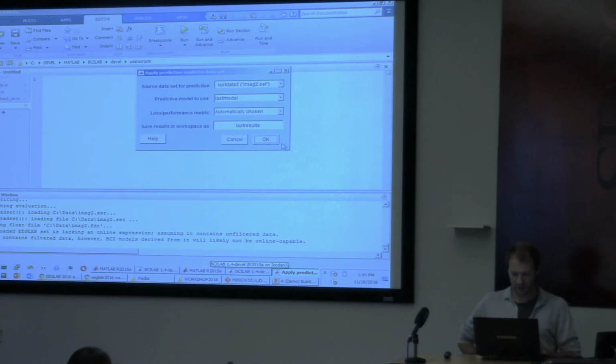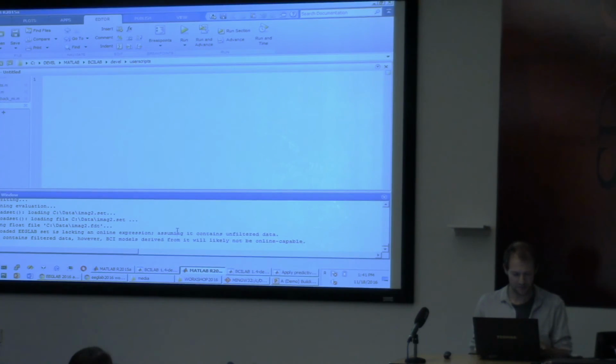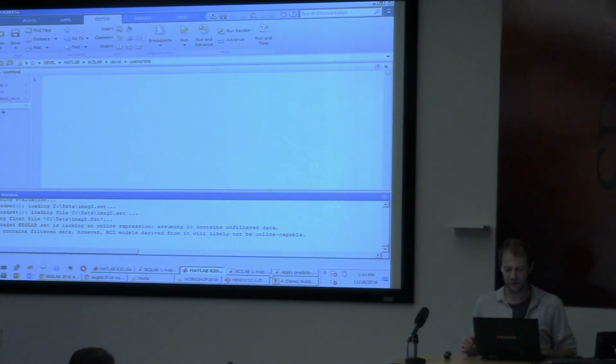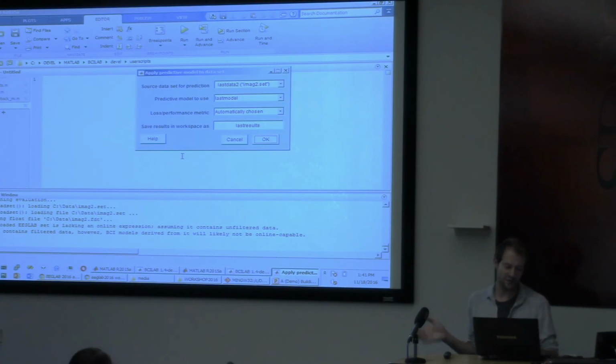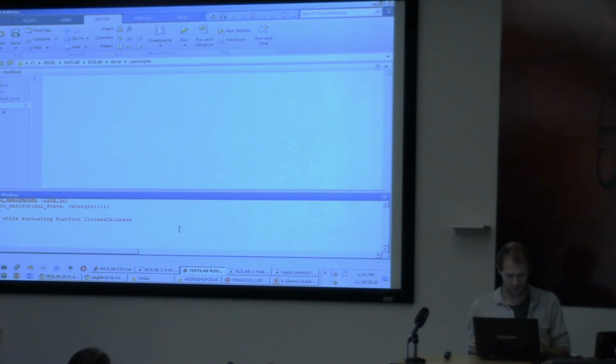This thing will spit out another table just like the one we just saw, and basically give me the offline results for how well that method is working on these data. And then I can visualize that. I can tweak some more parameters, and you'll get to see. Well, actually, it turns out we started late, right? So that's why I still have a bit of time. But honestly, I don't feel like waiting here. Maybe my laptop is a little overloaded.